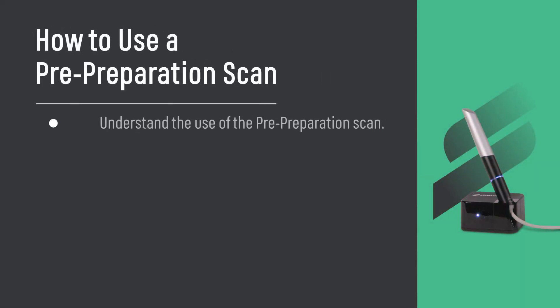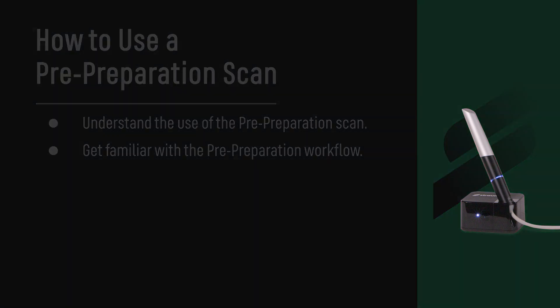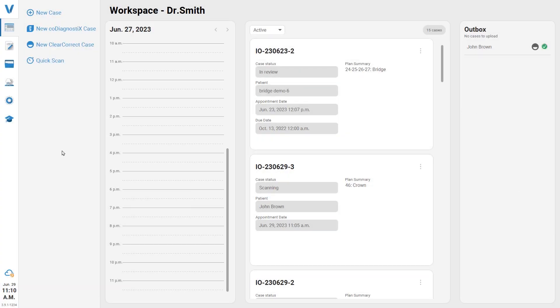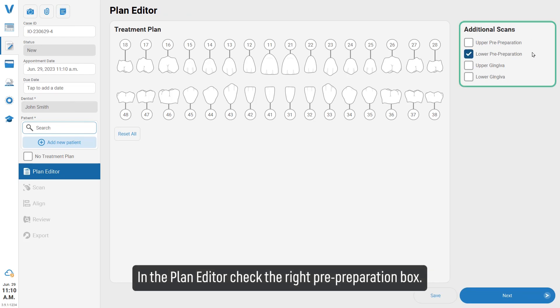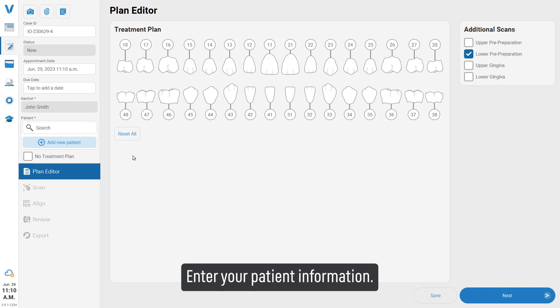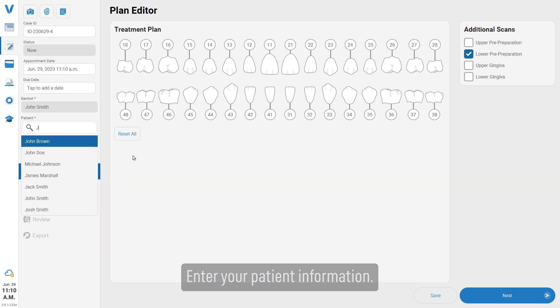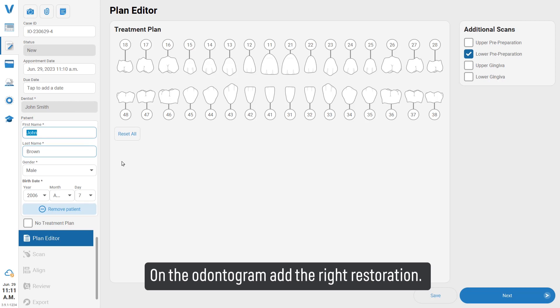Learn how to use a pre-preparation scan and understand the pre-preparation workflow. Select a new case in the plan editor and check the pre-preparation box. Enter your patient information on the odontogram.